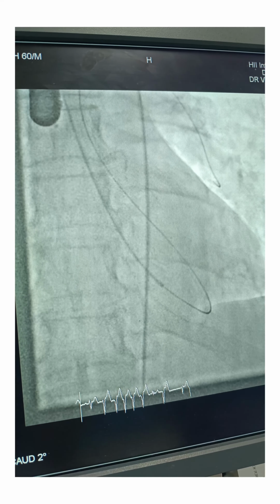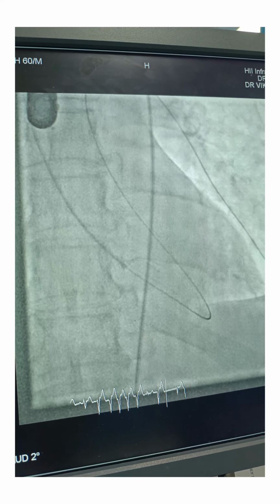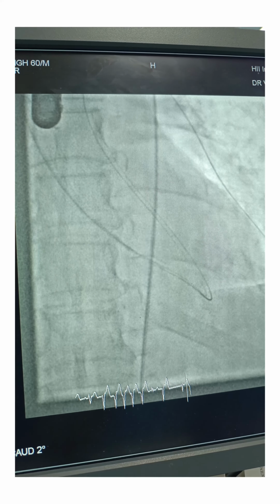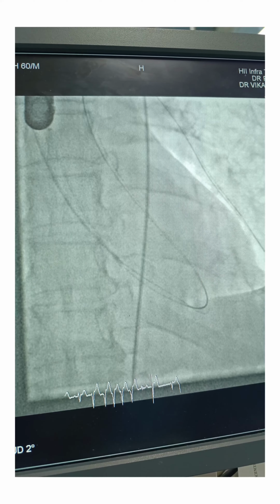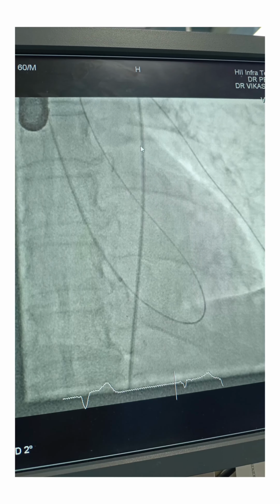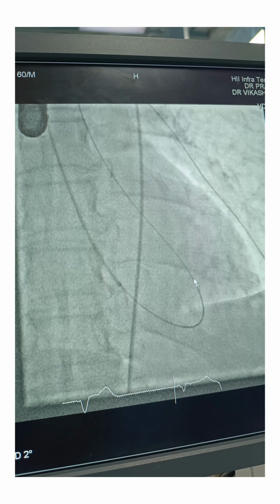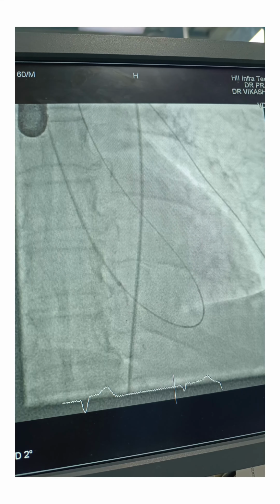Start. So as expected, this crossing was a little difficult because the tunnel was serpentinous inside the interventricular septum. So I had crossed with a J-tip 0.032 Terumo wire. Now you can see my wire is already in PA. So the catheter course being, this catheter is coming from the aorta to the arch to ascending aorta to LV through VSD. Now I am going to RV, PA, and then that is LPA.